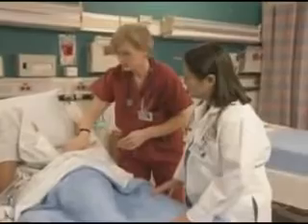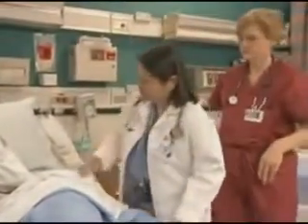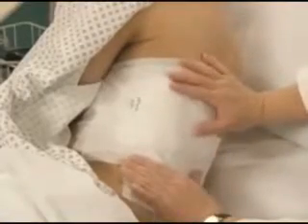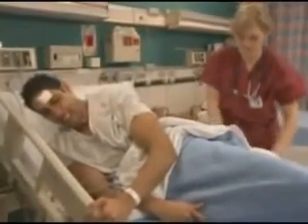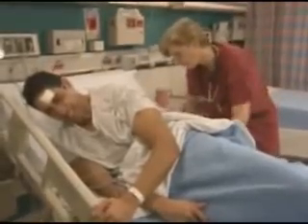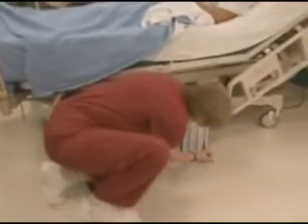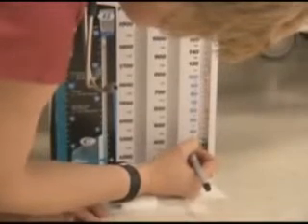Well, actually, doctor, I think there's a little crepitus. If you detect subcutaneous emphysema, immediately notify the physician, who may reposition the chest tube. To facilitate chest drainage, reposition your patient at least every 2 hours and maintain a high Fowler's or semi-Fowler's position if tolerated. Check the character and volume of the chest drainage once every hour or more often.